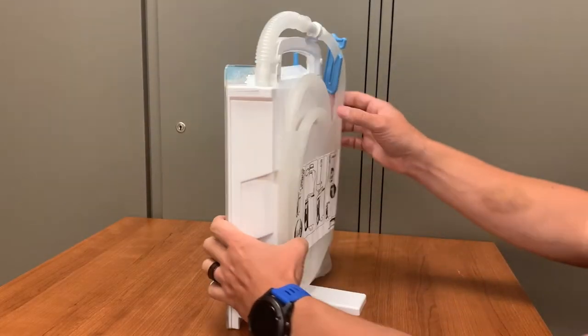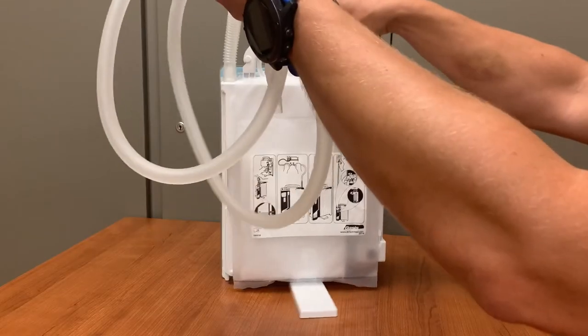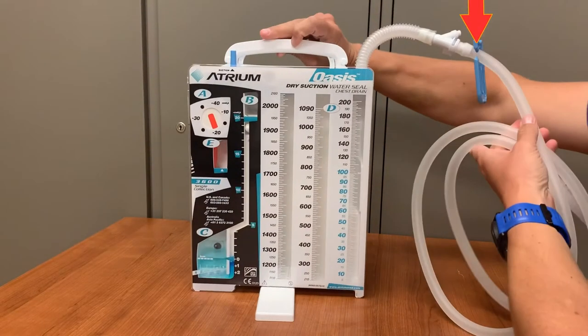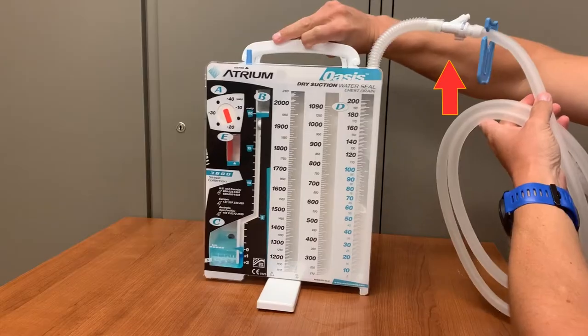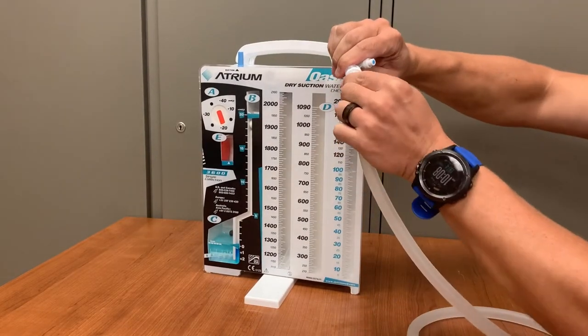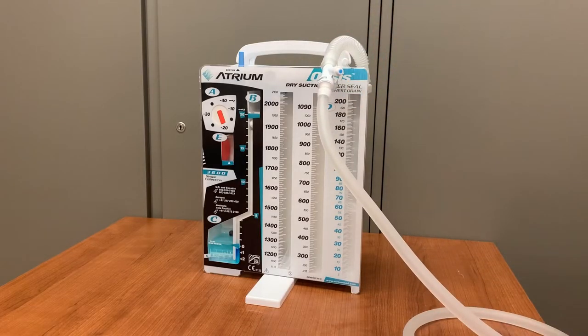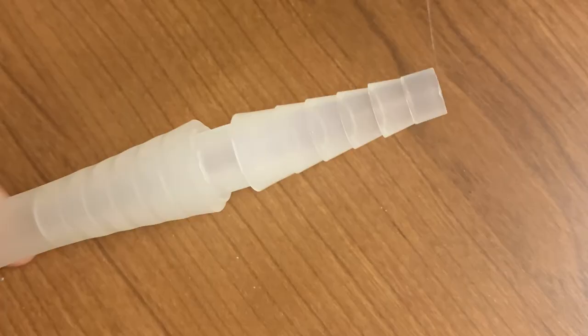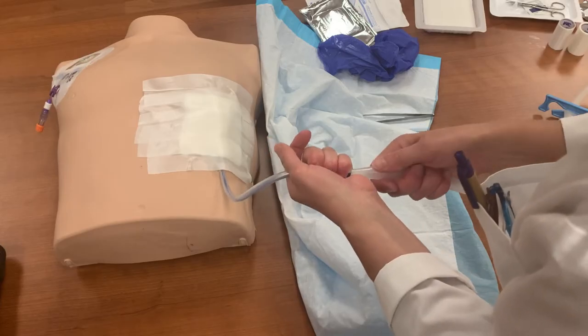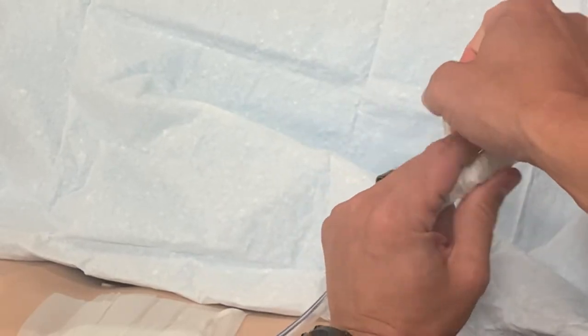Attached to the unit, and stored in a pouch on the back of the Oasis, is the tubing that will connect to the chest tube. There is a large clamp on the tubing, as well as an inline connection. This connector will allow the nurse to quickly disconnect the unit from the tubing to replace it with a new Oasis drainage system without having to replace the tubing. The Christmas tree-shaped adapter at the end of this tubing will be inserted directly into the end of the chest tube. Tape can be applied to this connection to protect it from accidentally being pulled apart.